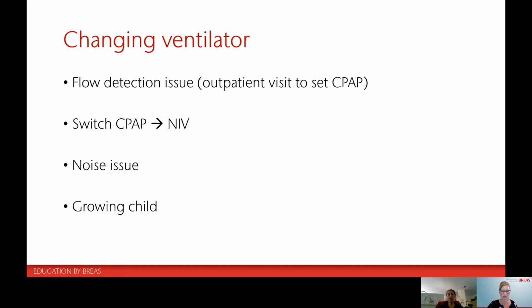What is the main point of this change? It's just because for the family, it's very easy, because you don't have the life support with the external humidifier anymore, but you have everything less heavy, which takes less place, and you can have an inbuilt humidifier. It's just a question of practicability.